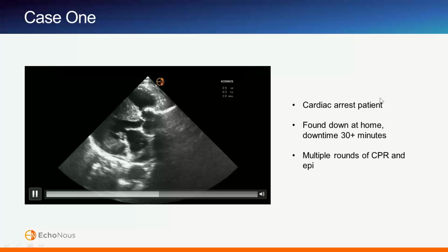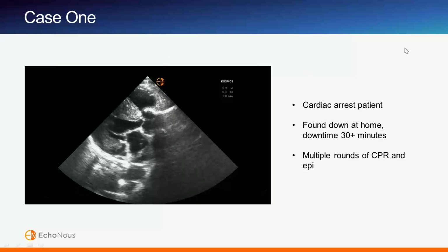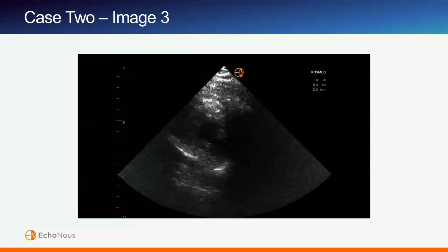I would agree. Cardiac standstill is more predictive of a poor outcome. Depending on which paper you read, some can say 80% to 95%. If patients are coming in with persistent cardiac standstill and you've tried, then it's going to be unlikely that they're going to survive that. Yeah, if the patient is in cardiac standstill and they're asystole on the monitor and there's no signs of life, if I am seeing that on my ultrasound, I usually just terminate the resuscitation right there. There probably are some exceptions, like young patients, like pediatric patients, but for the most part, I would agree with you on that.